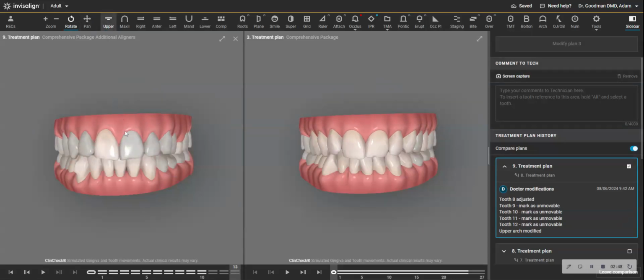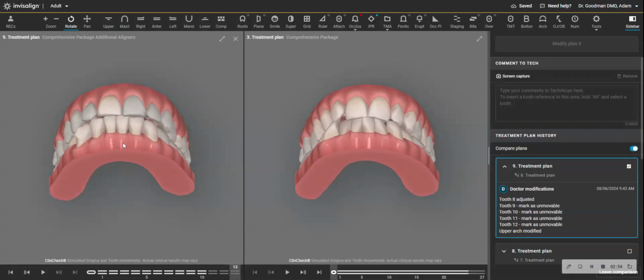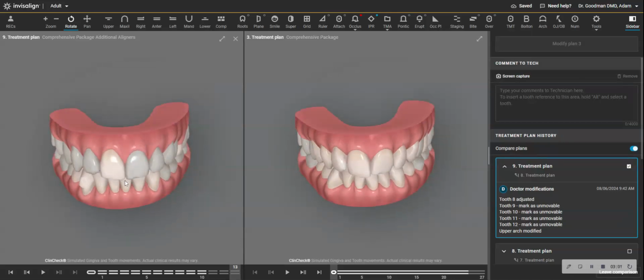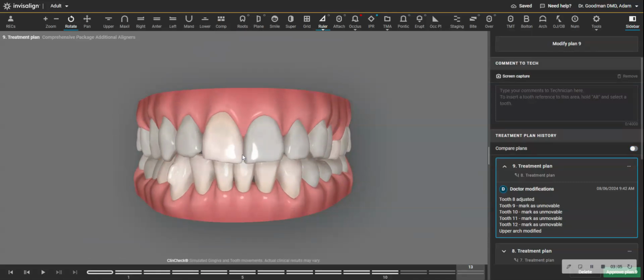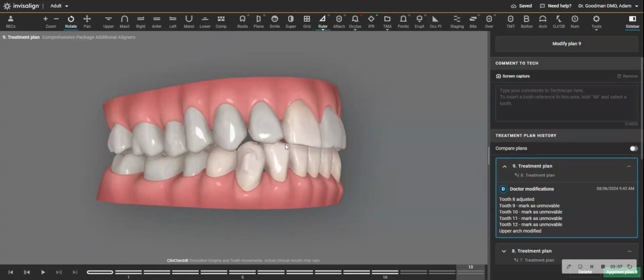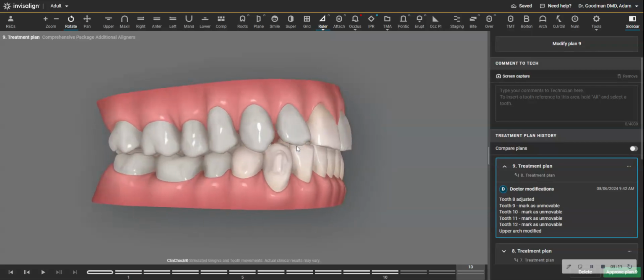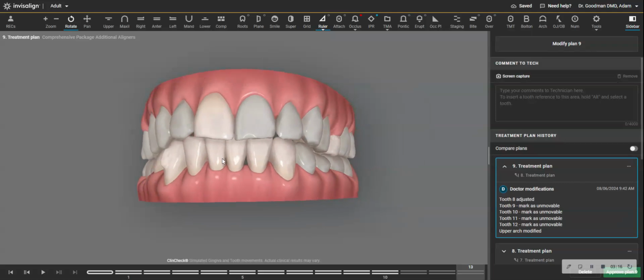But it's very tempting when you're starting out with Invisalign, if you're an orthodontist, certainly not an orthodontist, to kind of worry about not opening up spaces. But sometimes it's really the way to go, because the spaces that are currently in this person's mouth, if you look right now, imagine this person just walked in as a brand new patient and they had these spaces and they didn't like it. You might think, hey, let me use Invisalign to close those spaces. That would be simple. I'll just sort of constrict the arch, but that won't work with the lower.